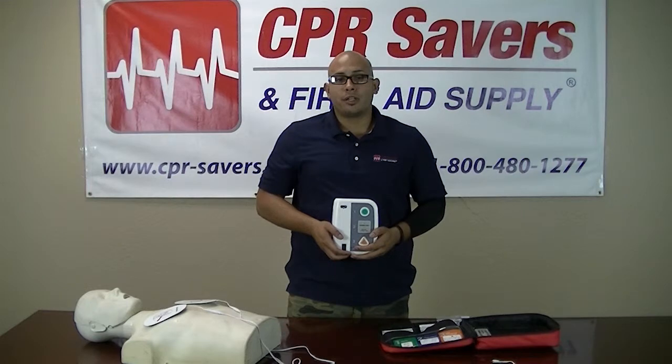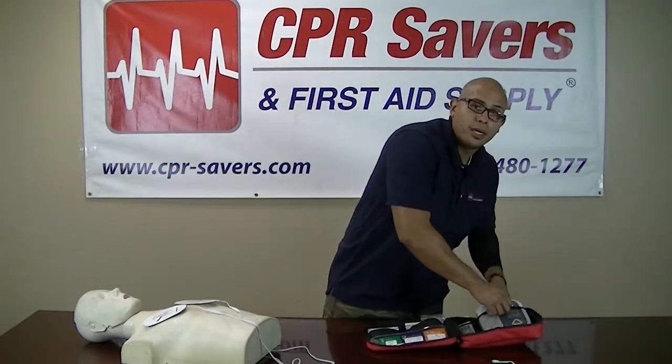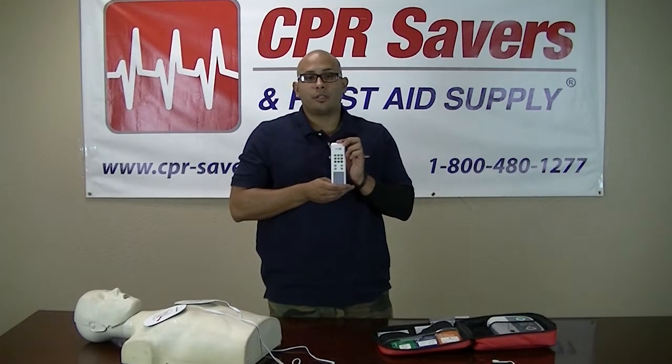The XFT trainer comes with a wireless remote which allows the instructor to make several changes while standing away from the device as the students use it.